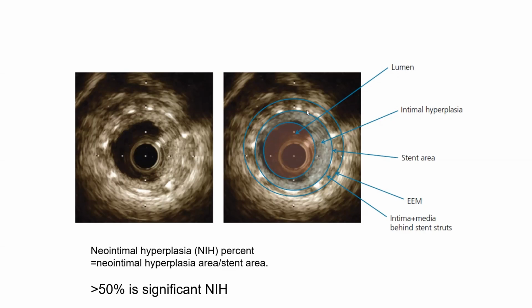The important thing is what's within the stent. So here is what we look at when we do intravascular imaging. When we look at that stent area, the minimal stent area, we compare it to the distal reference and proximal reference area. You could use, like I said, the distal external elastic membrane minus 0.5 millimeters. This is how you assess the proper stent expansion.